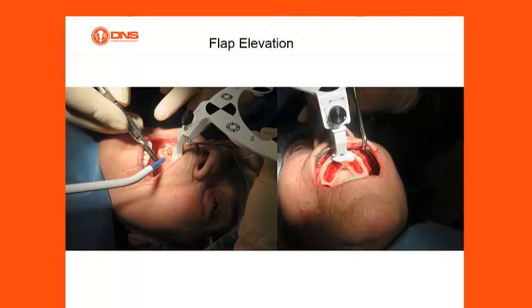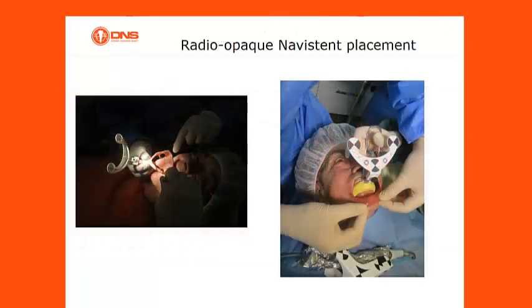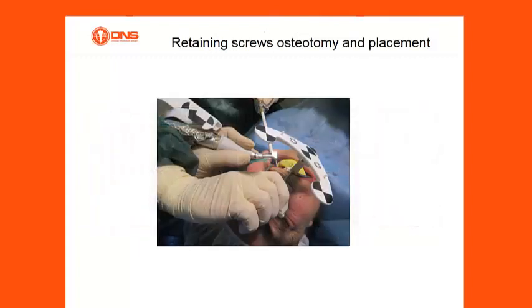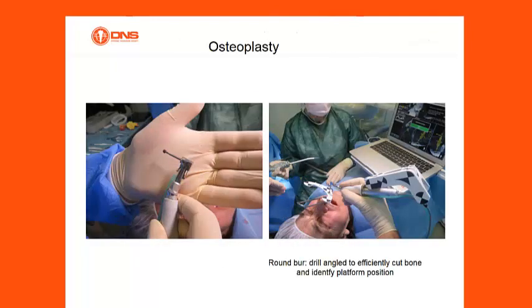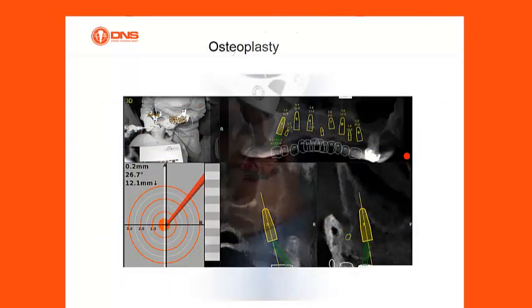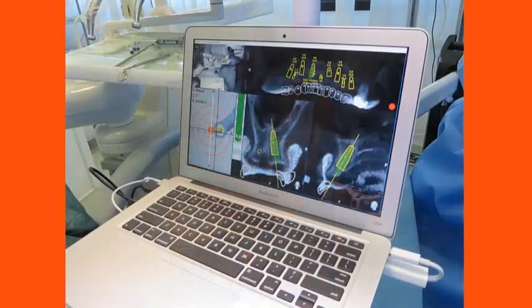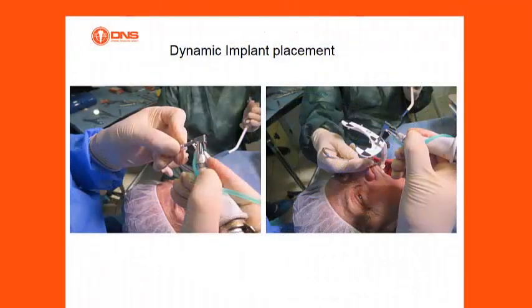Continuing the clinical protocol: flap elevation is performed, followed by radiopaque Navistent placement. Retaining screws are inserted, osteotomy is carried out, and implant placement follows. Osteoplasty is then performed as planned. The sequence concludes with dynamic implant placement guided by the Navident system.